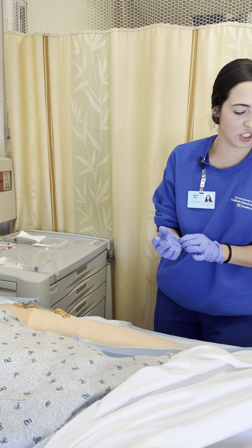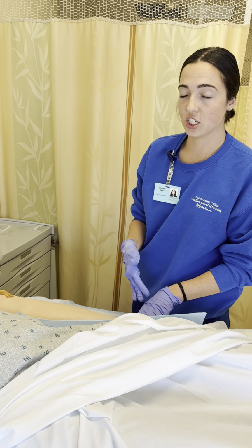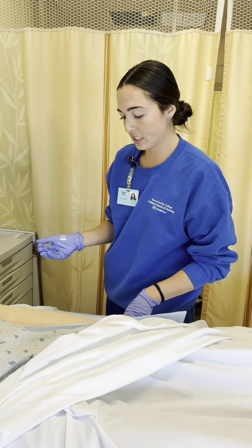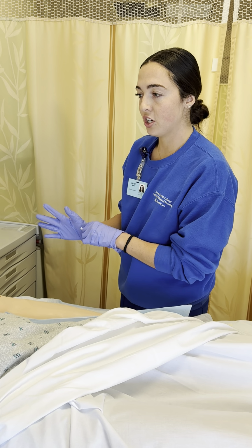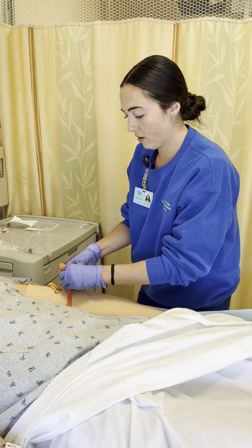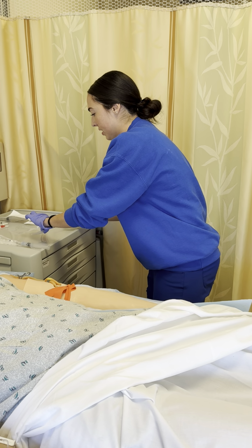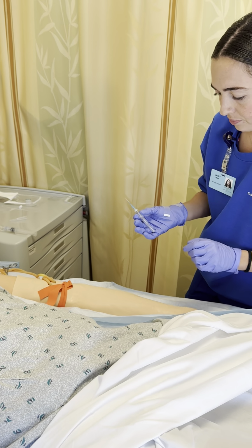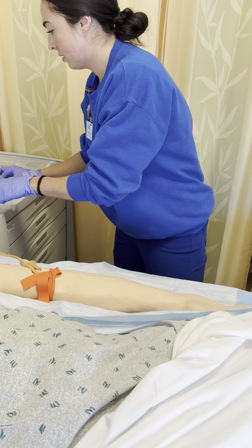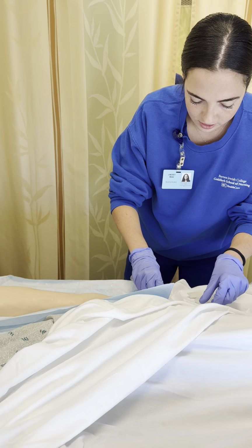Okay, so I'm going to go over the IV again. I'm going to make sure that everything looks good. I'm going to be sure not to touch anywhere that I have already wiped down, otherwise it becomes unsterile again. And we're going to get started. Ivy, would you like me to count down? No? Okay, so we're not going to count down for Ivy. We're going to tie this tourniquet back on again. Needle ready. Okay. I'm going to move this closer to make it a little bit easier to grab.